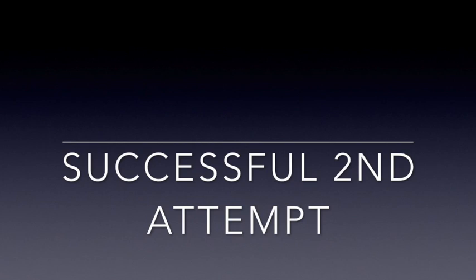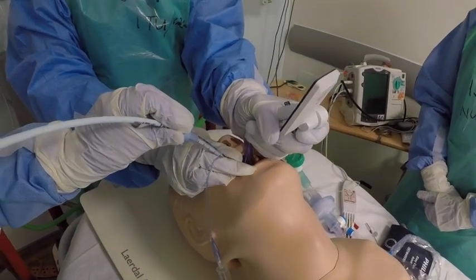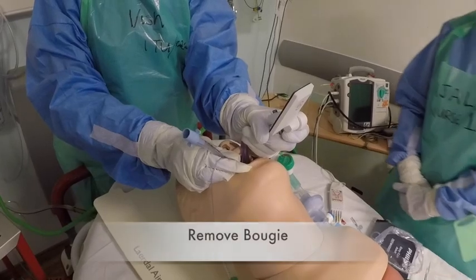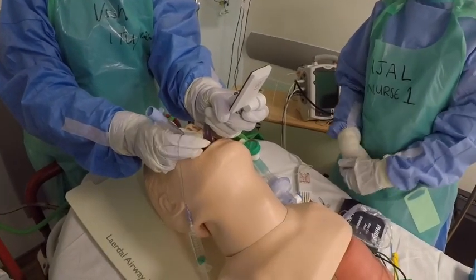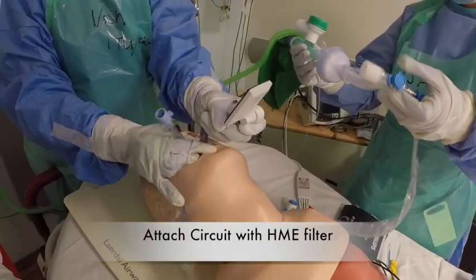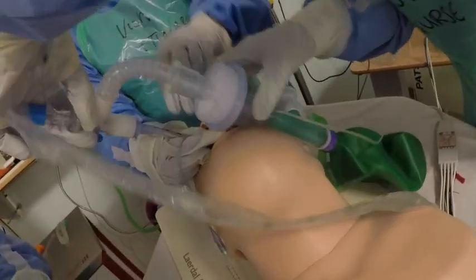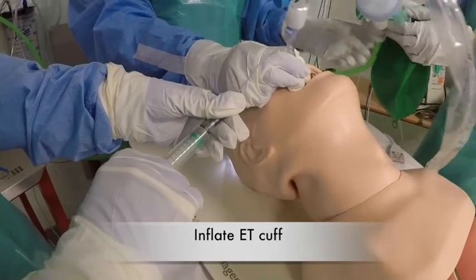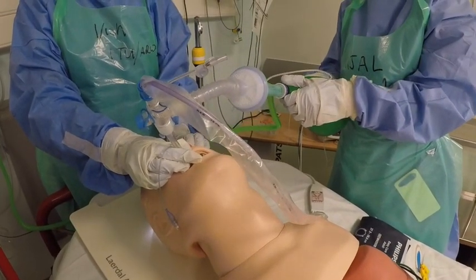In our example, intubation is managed successfully on the second attempt. We have used a bougie, though a stylet pre-loaded in the ET tube is also acceptable. The bougie is removed as normal and there is a prioritisation of getting the circuit connected quickly. When the circuit with HME filter is attached, the cuff of the ET tube will be inflated — it is only after this that the first breath should be given to the patient. All of these steps are designed to try and minimise aerosolisation into the room.